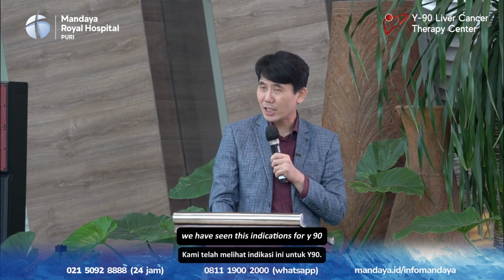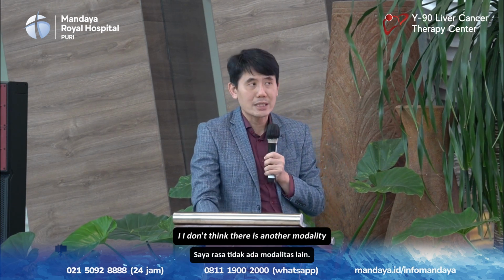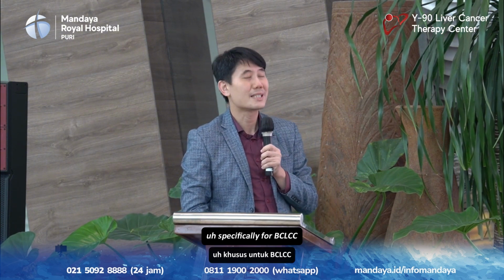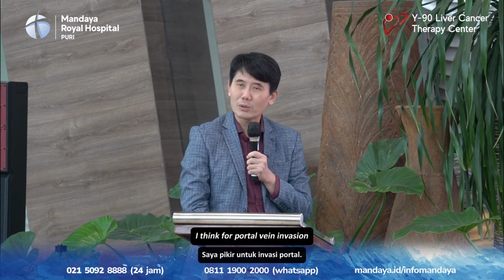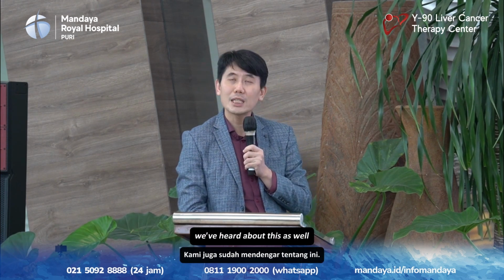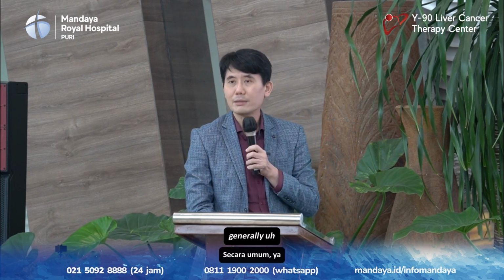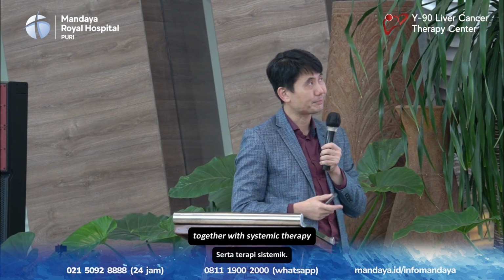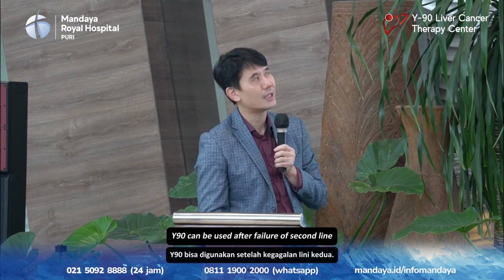We have seen these indications for Y90. I don't think there's another modality that can go from BCLC-A to BCLC-C. Specifically for BCLC-C, for portal vein invasion, I think Y90 is a very good modality. We've heard about this as well. It can be used in intrahepatic cholangiocarcinoma. Generally, for intrahepatic cholangiocarcinoma, if they are at a more advanced stage, it is together with systemic therapy. For metastatic CRC, Y90 can be used after failure of second line.